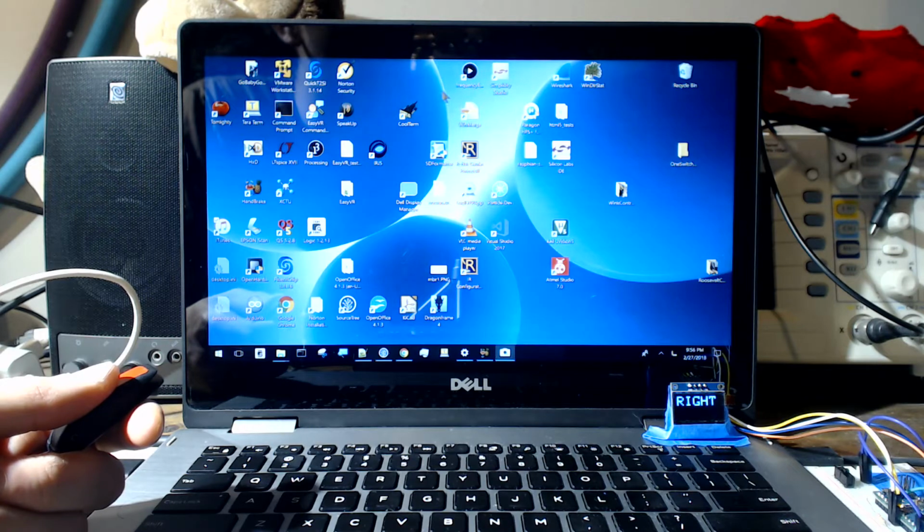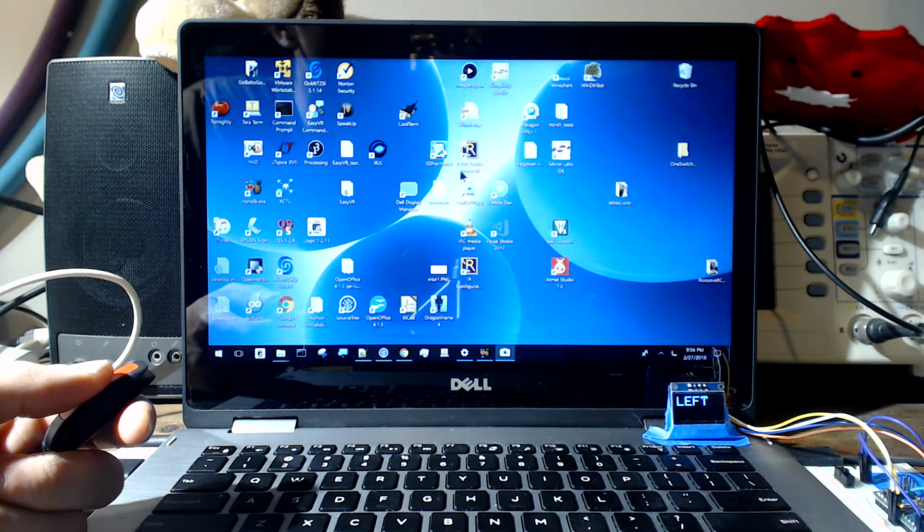You'll see with each press of the accessibility switch in my left hand, the mouse moves in another one of its four cardinal directions. A longer press will allow me to do also a left click, right click, or double click. You can see in the display on the lower right hand side of my screen what it's currently doing.